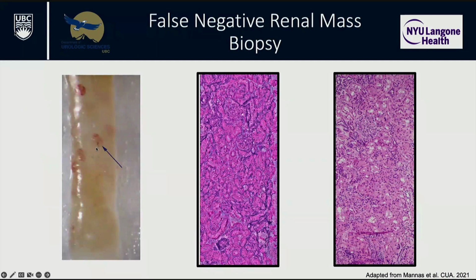Now, this is a really obvious example because anecdotally, there are lots of examples of, I took a biopsy, a benign renal pathologist, their job is just to look at this, says there's no glomeruli. They then take another biopsy, and in the end, there were like 10 glomeruli. So it's challenging even for experts, and it's not done at all centers just because of the resources required. They have to be on site because it's light microscopy.